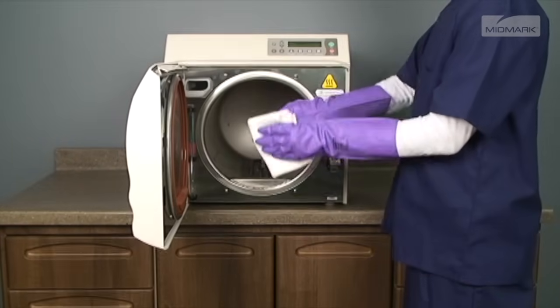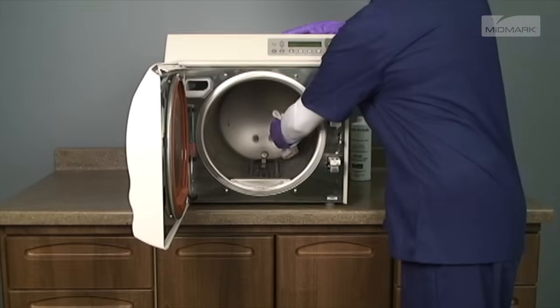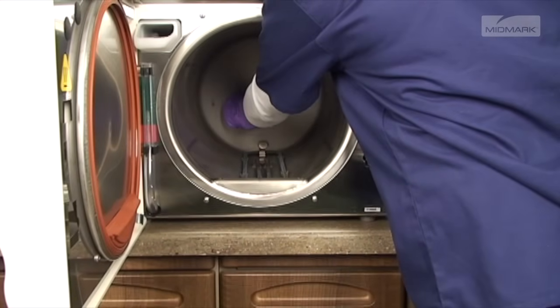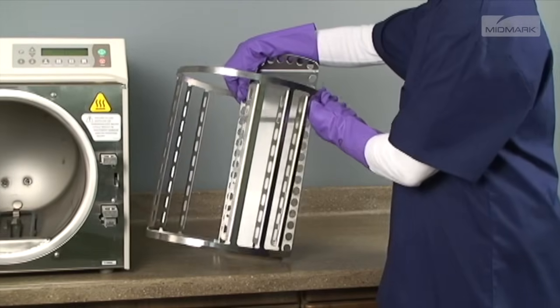Wipe the inside of the autoclave chamber, being careful not to damage the heating element, steam temperature probe, or water level sensor. Re-insert the filters into the appropriate holes by pushing downward while twisting slightly. Re-install the tray rack.